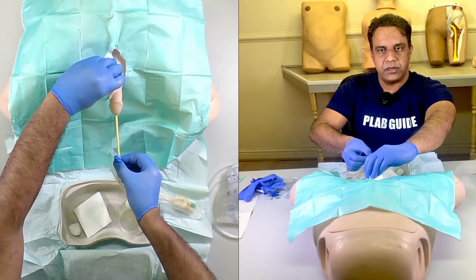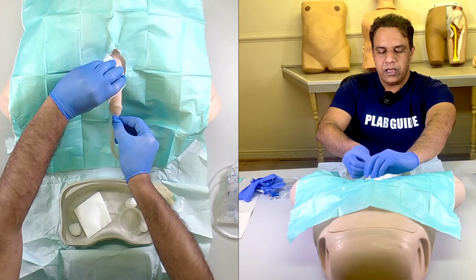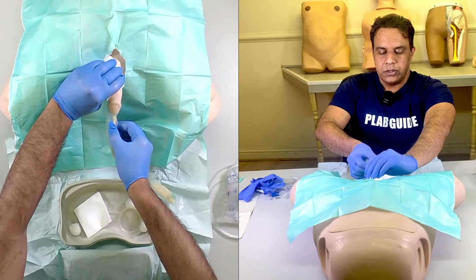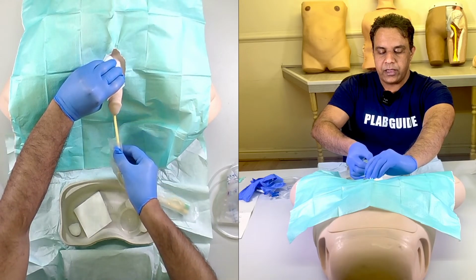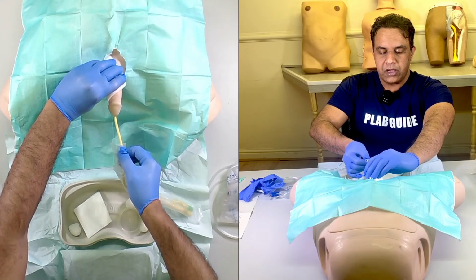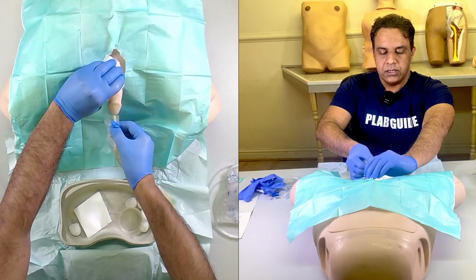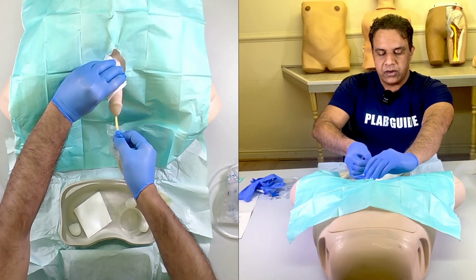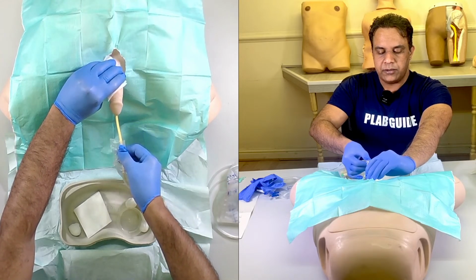Warn the patient again, insert it gently, and then pinch it to hold the catheter in the penis and slide the covering back. Pinch the catheter again with the covering outside, insert and slide it back.